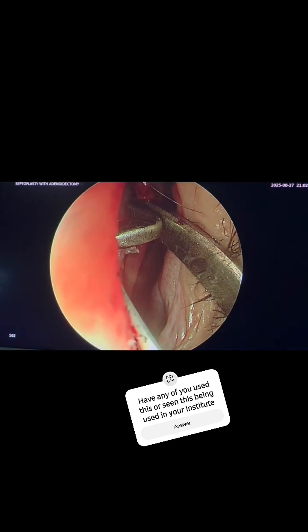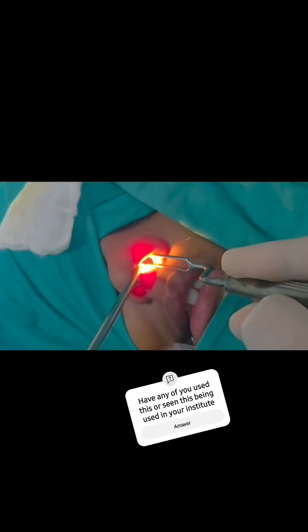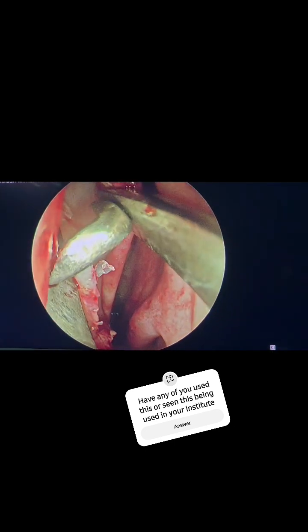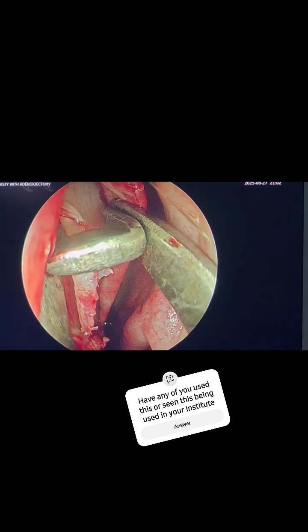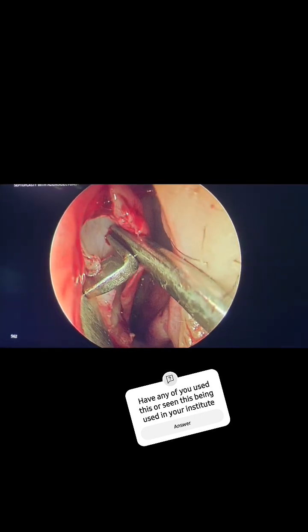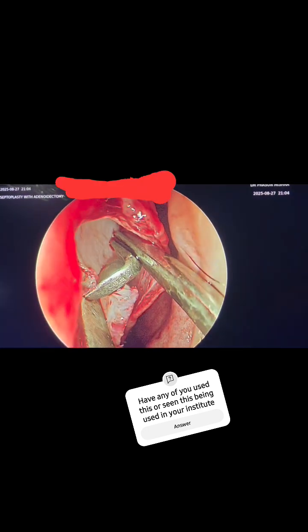This is how I am holding it. Once it is on both sides of the cartilage, I will just have to push it down. The advantage of the swivel knife is that it can be moved in any direction and we can give the cut in any way we want along the cartilage.